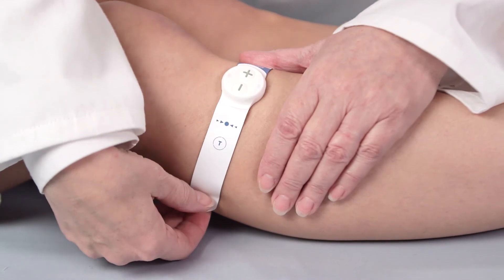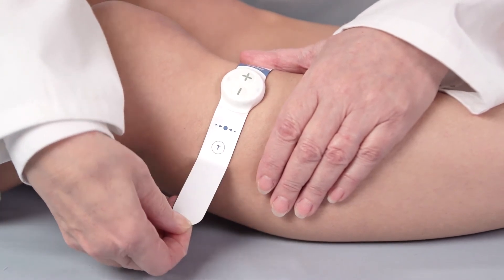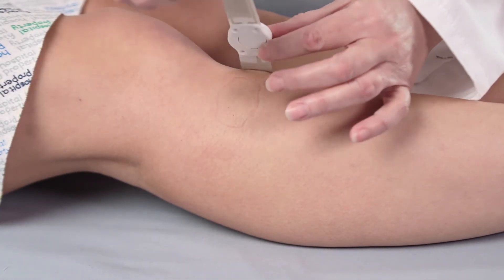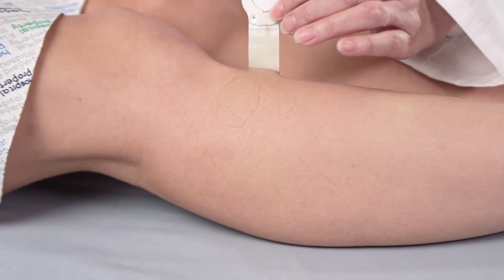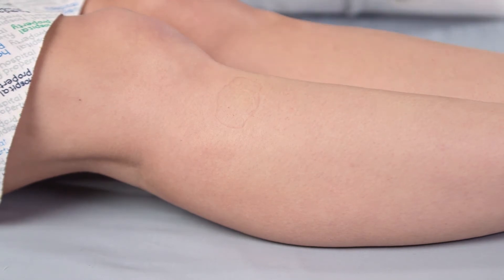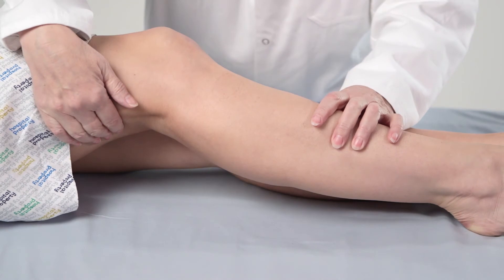To remove the Gecko, gently lift the long end of the device, taking care to peel the adhesive gel off the skin along with the device. Lift the device away from the leg progressively without bending it double. This will preserve the device and prevent damage to the skin.